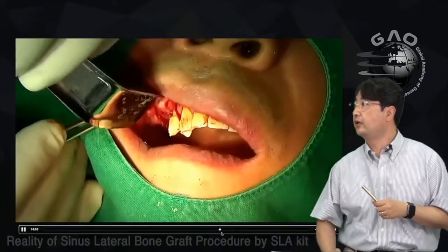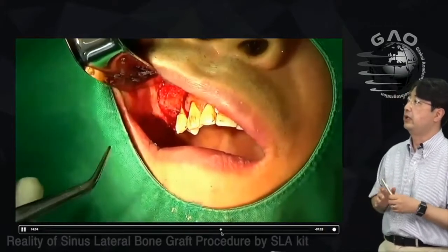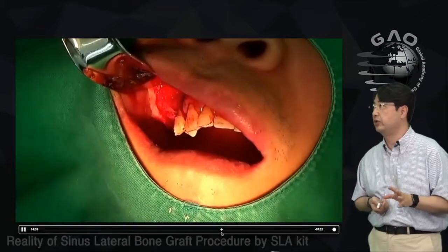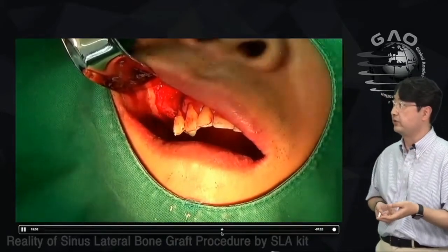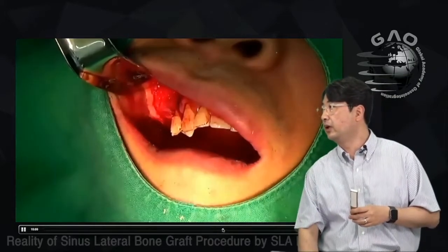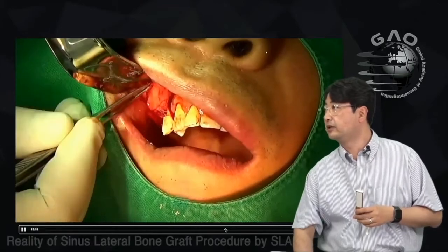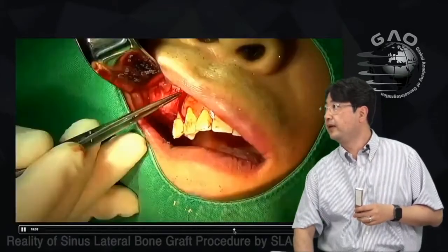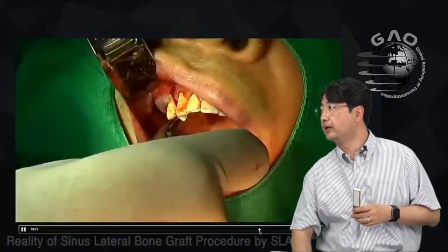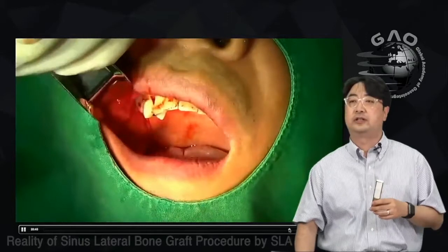I cover the anterior opening with PRF membrane. In this case, I didn't need to create a new window — the window was already there from the previous surgery — but it was a bit large so I covered it with PRF membrane. Then I made sutures to close the wound.